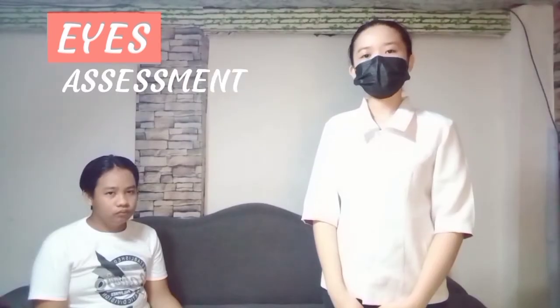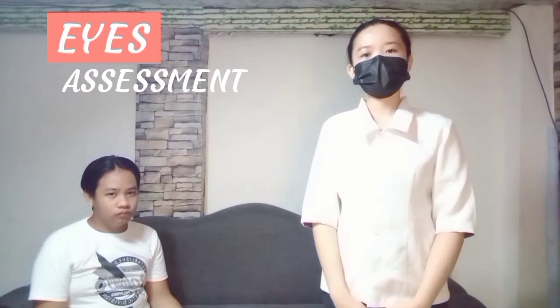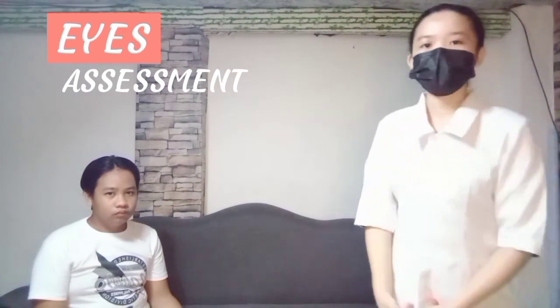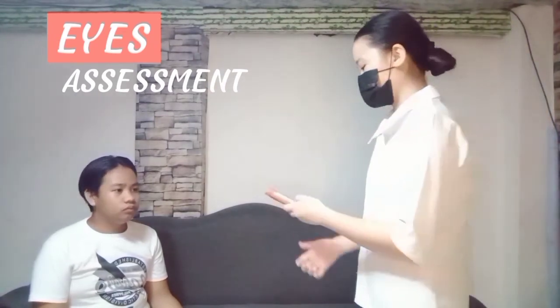So now we can proceed to inspecting the conjunctivae, the sclera, and also the cornea of our patient. So inspecting the cornea of our client, we want to have the test for corneal reflex, and in order to do that, we need to grab our penlight and shine the light just in the middle of the pupil.